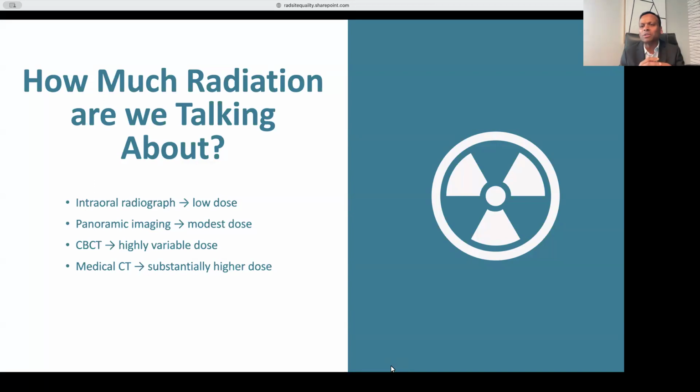You can say it is like 1 to 2 years of background radiation. So for cone beam CT, more specifically, if you think about it, it's going to give you as much dose as you would get taking a transatlantic flight. Okay, so that's the way I explain it to patients when they want to relate how much dose they received. That's a very helpful context.